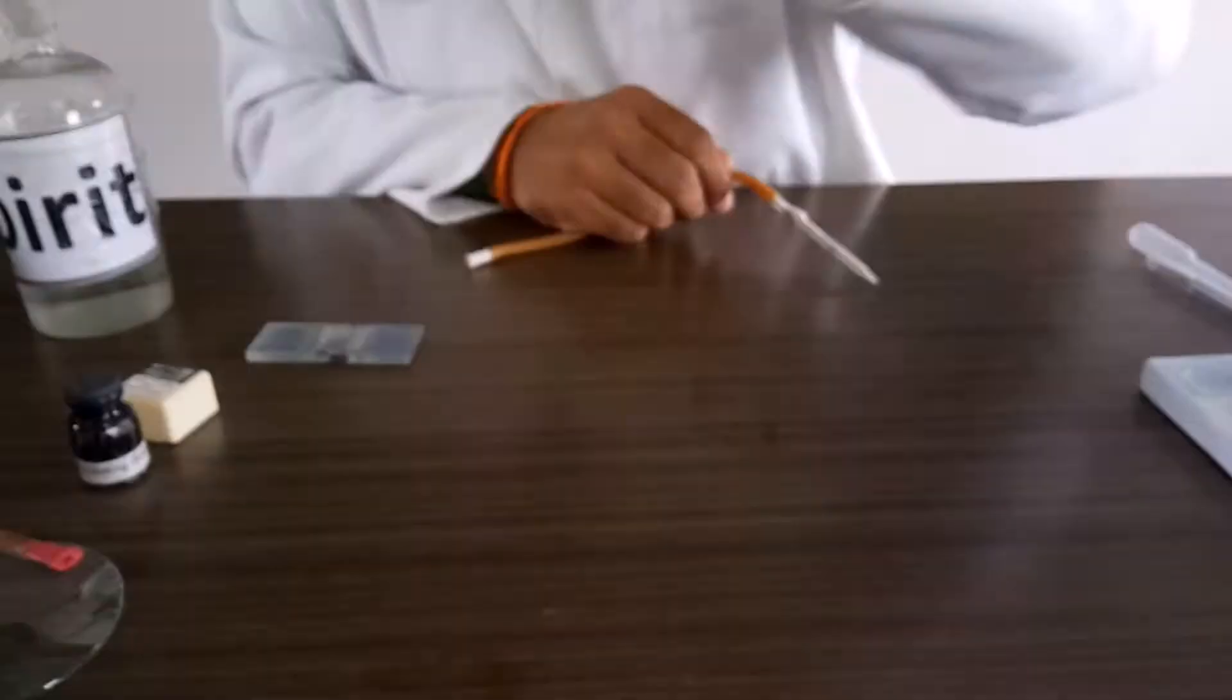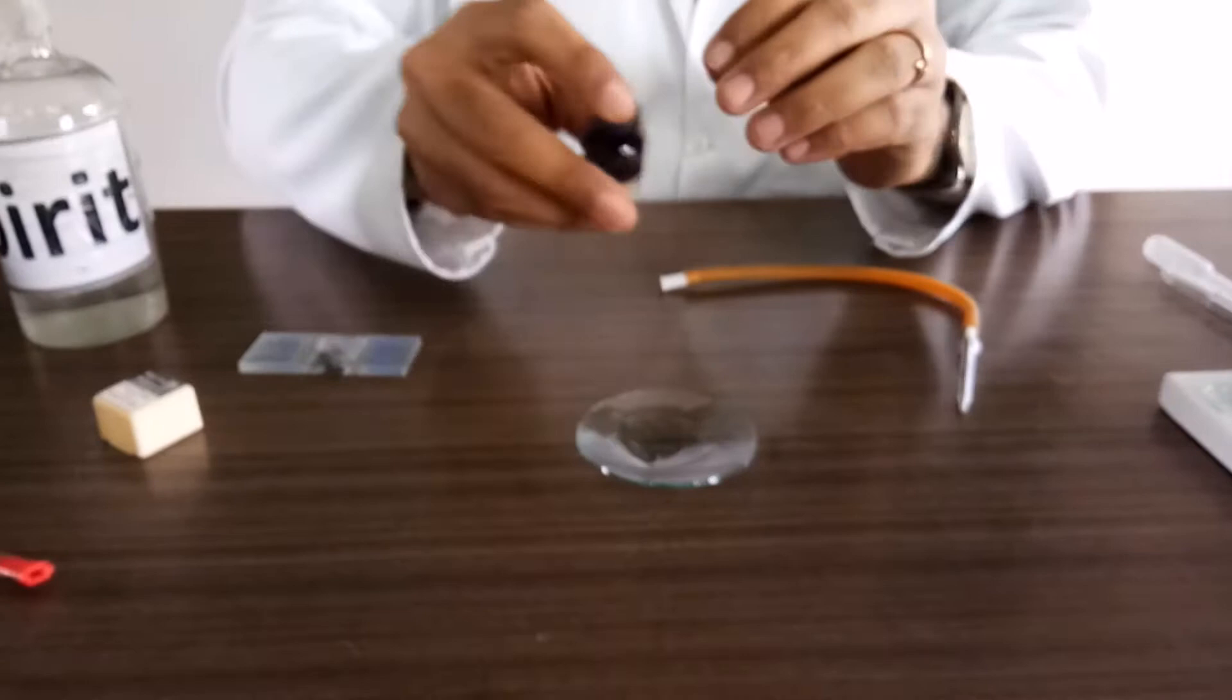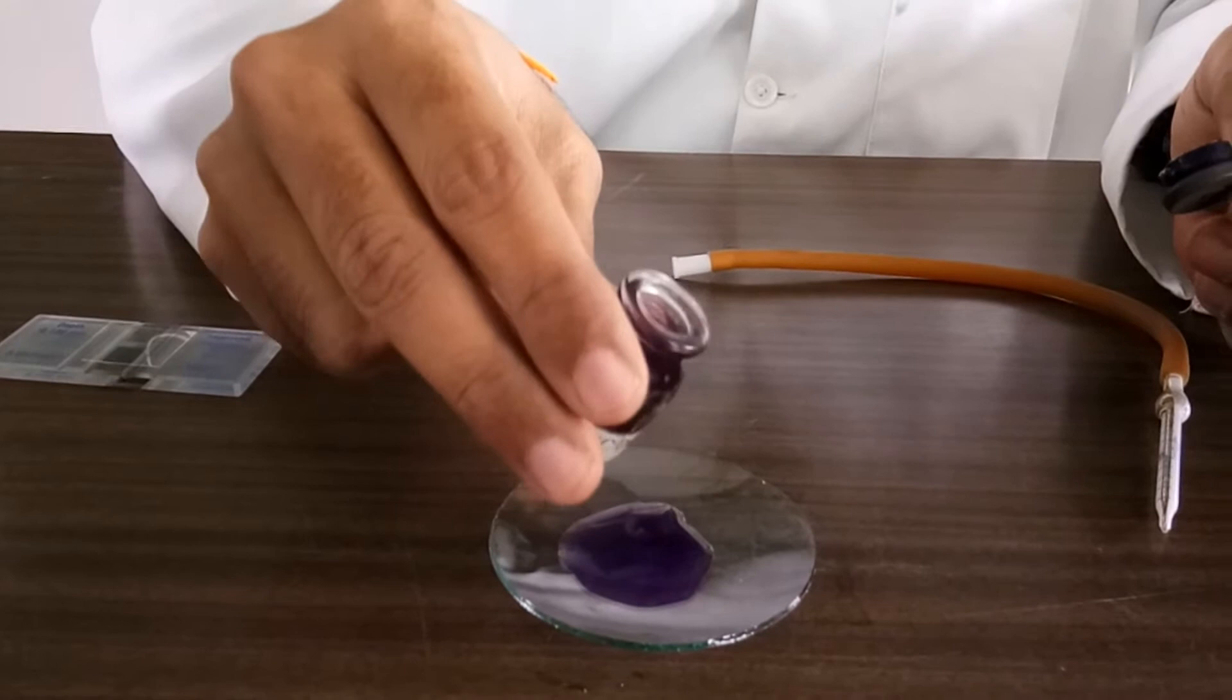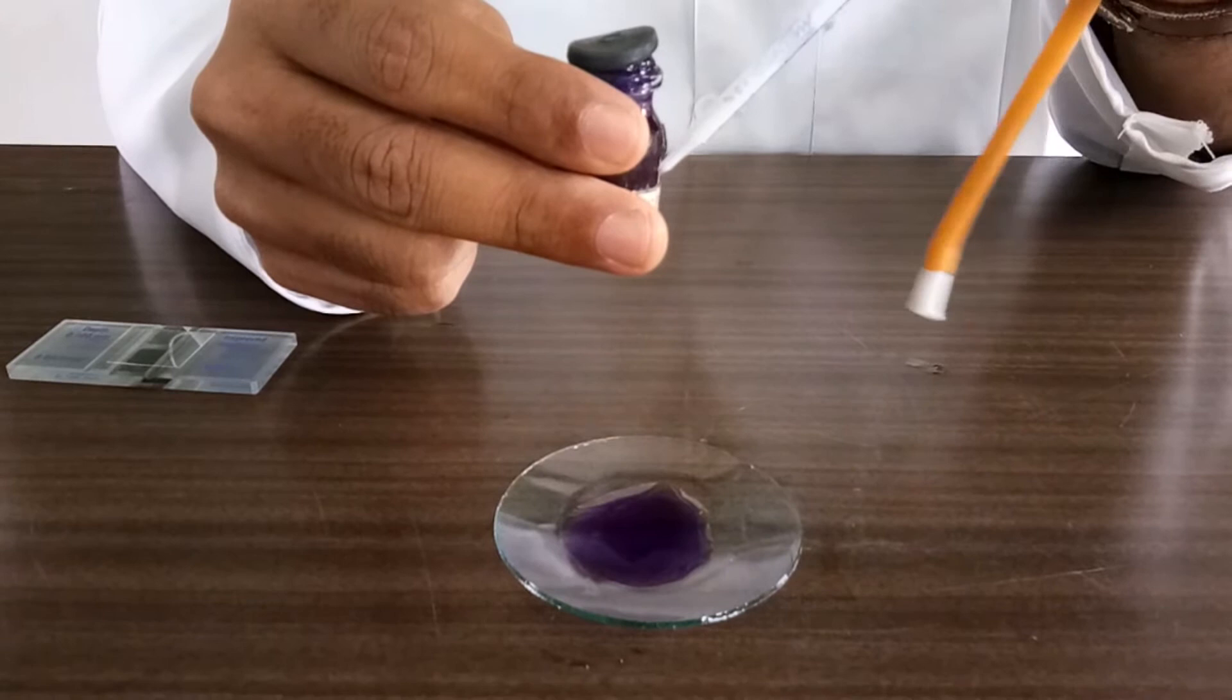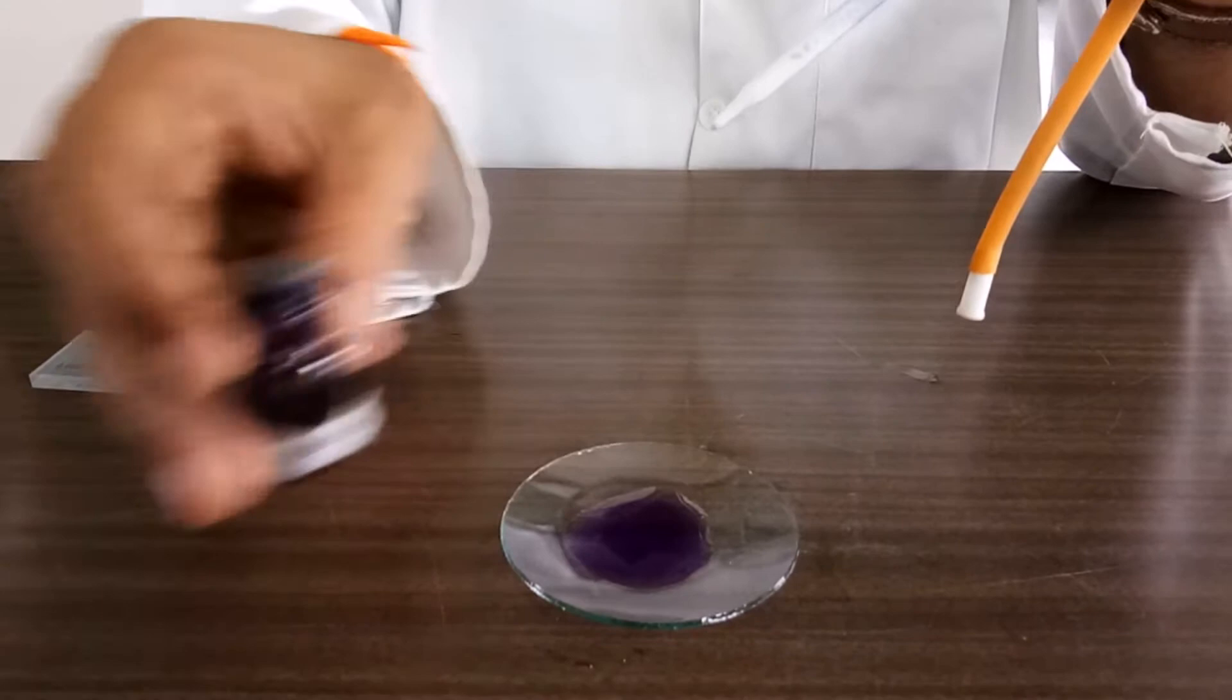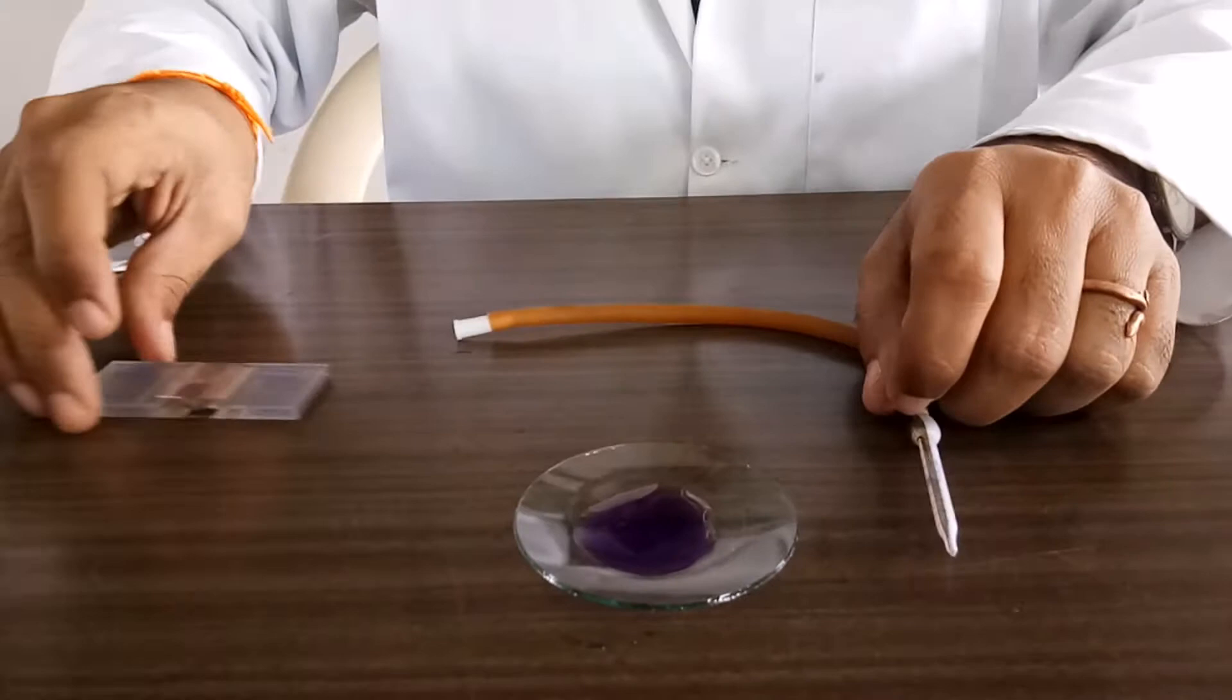Now close that particular box and keep it aside. Take the watch glass. Transfer the particular WBC diluting fluid. Transfer little amount which is required amount. Don't take entire. Don't contaminate the particular diluting fluid by inserting the sample or directly you can take the diluting fluid from here which is contaminate this entire bottle. So transfer adequate amount of diluting fluid which is required. The setup is now ready.